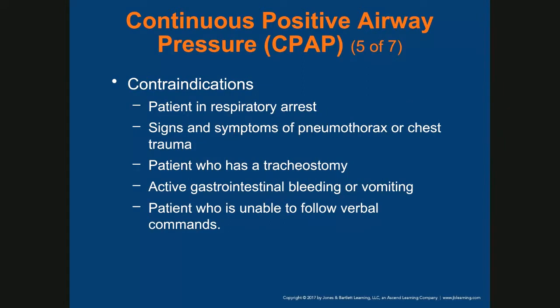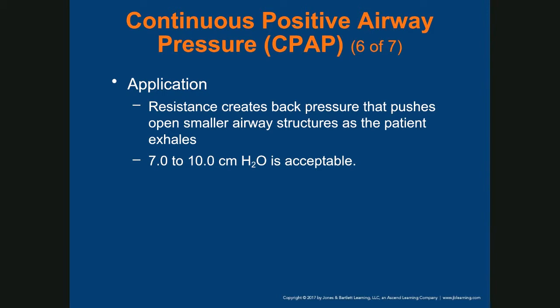Contraindication: patient in respiratory arrest. Signs and symptoms of a pneumothorax or a collapsed lung. Chest trauma. Patient who has a tracheostomy. Active gastrointestinal bleeding or vomiting. Patient who is unable to follow verbal commands. Right?